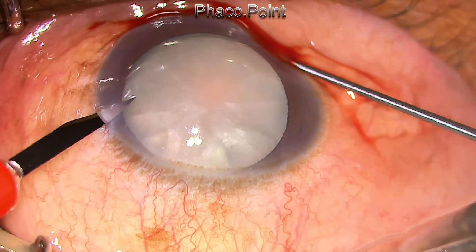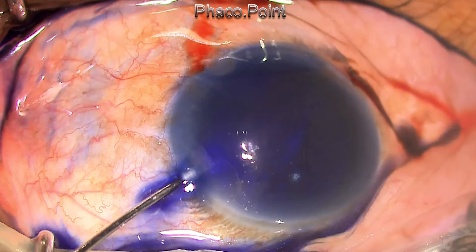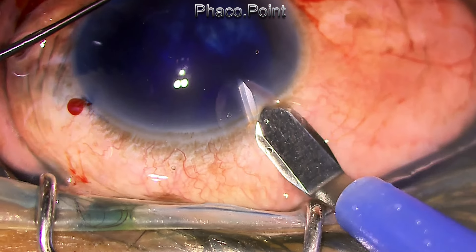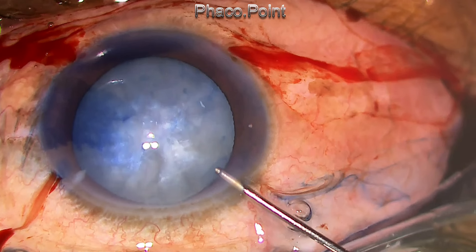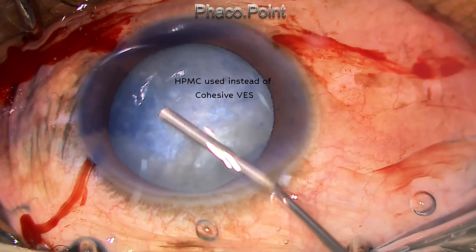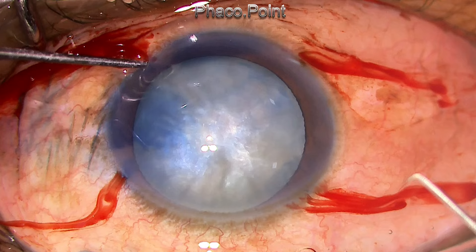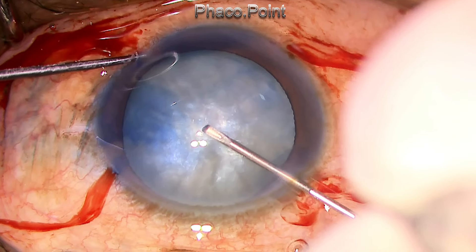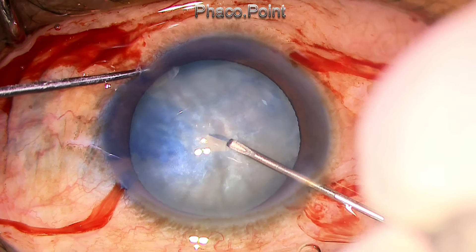In spite of giving the patient mannitol preoperatively, I forgot to use a cohesive viscoelastic because I did not have it at that time. After staining the anterior capsule, I found that the stain was taken up in a very mottled appearance. When I made the initial puncture, there was no escape of fluid, as you can see, because this was made of solidified cortical fibers.